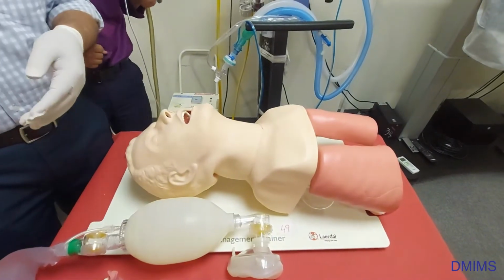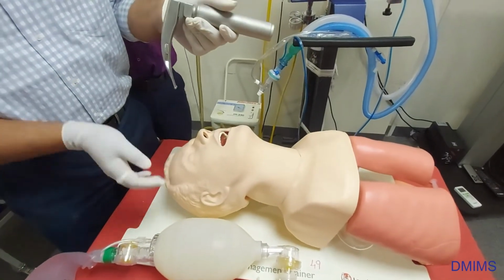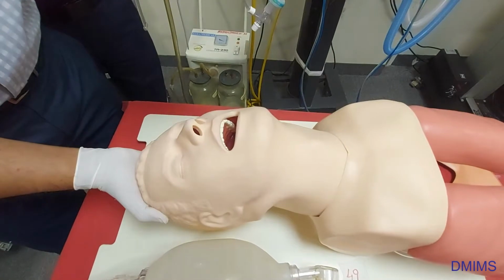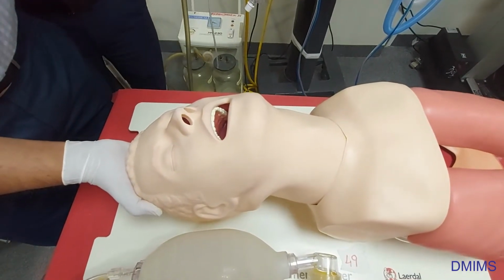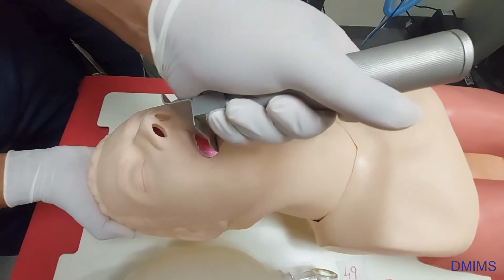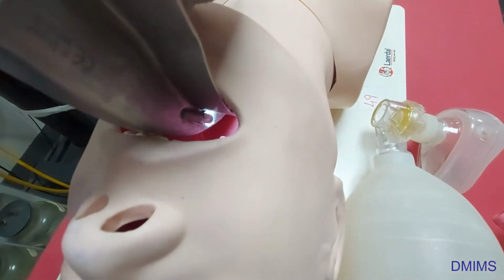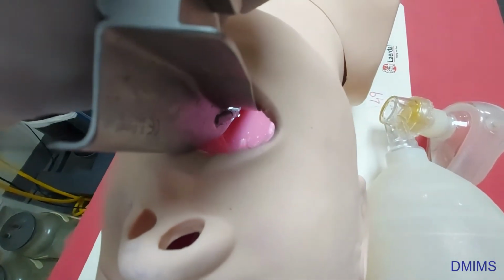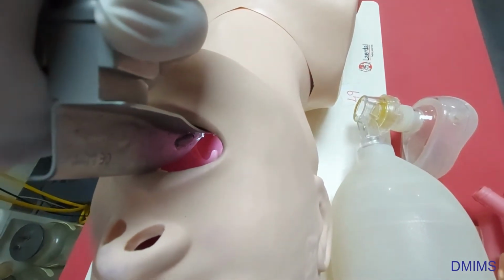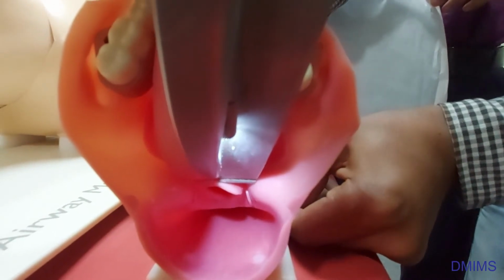As we have seen, there is a working laryngoscope light, and the proper size blade. You have to hold or fix the head with one hand, and hold the laryngoscope in the left hand. Enter the mouth from the right angle of the mouth, go in till you see the base of the tongue, and shift the tongue to the other side, the left side. I am going in till I am at the vallecula.